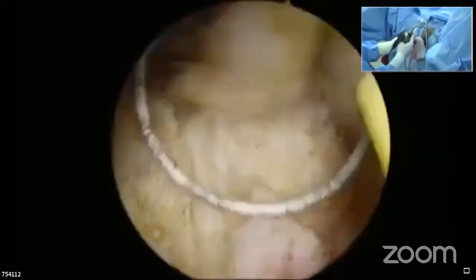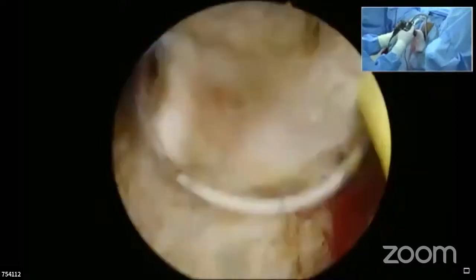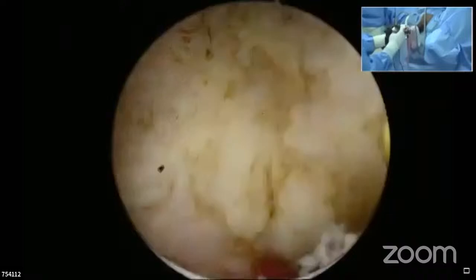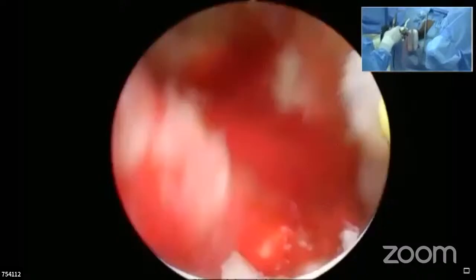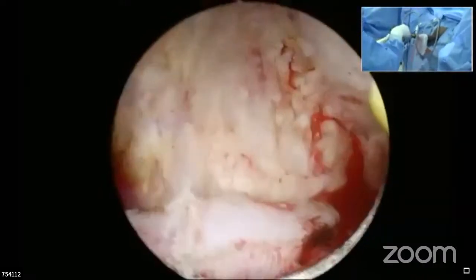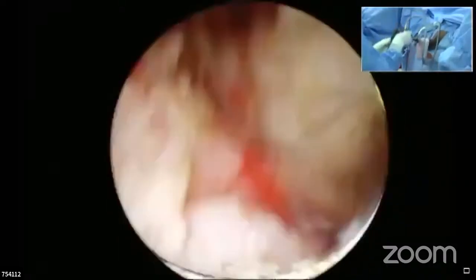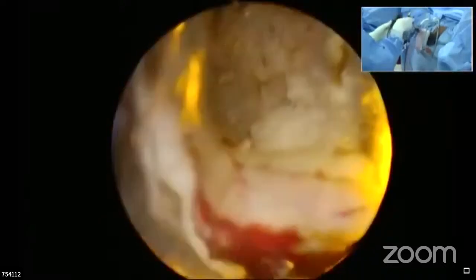Now, which cutting loop is best for TURP, thick or thin loop? We have discussed this. Again, it's the surgeon's choice. In Storz we have thin and thick loops, whereas in Olympus, as the surgeon has already said, there is only 1 loop. So it's a choice. You try both, see which gives you better results. My experience is that a thick loop should be used for prostate, and with slow cutting, it gives more hemostatic changes, and the loop life is also longer if you are using the thick loop.